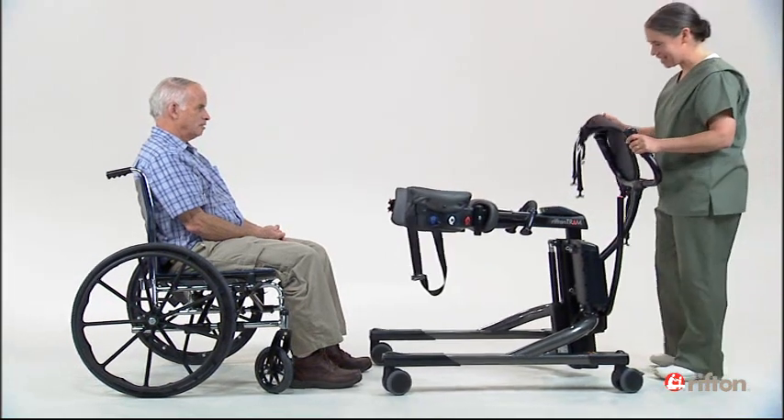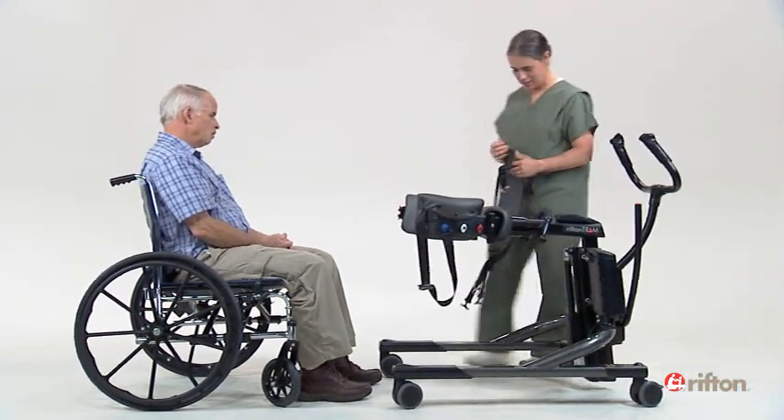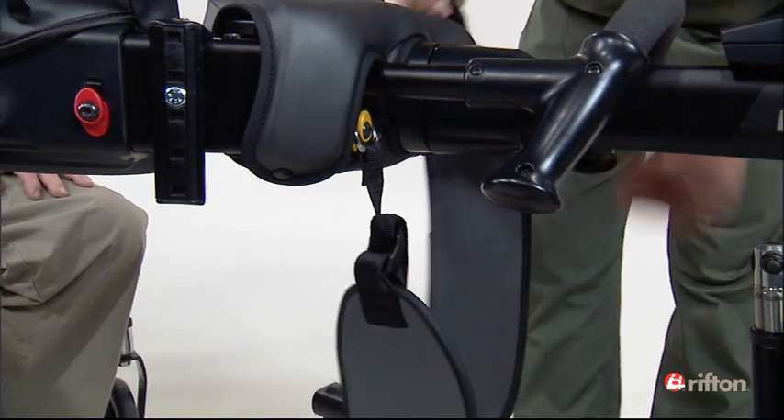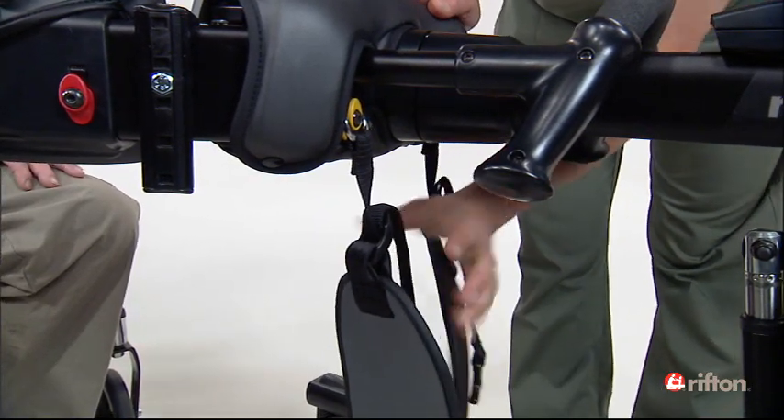Proper positioning will ensure your client is comfortable and secure. Attach the thigh straps onto the two yellow clips at the front of the body support, gray side facing the client, and adjust evenly.